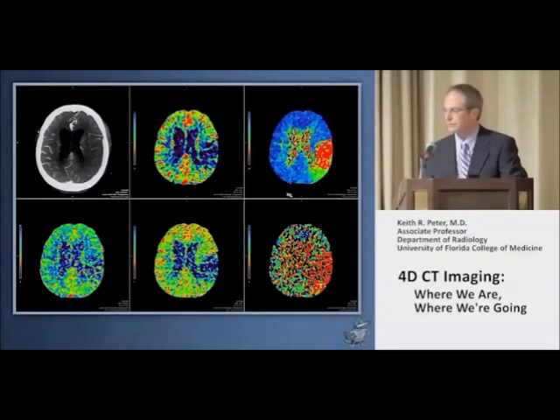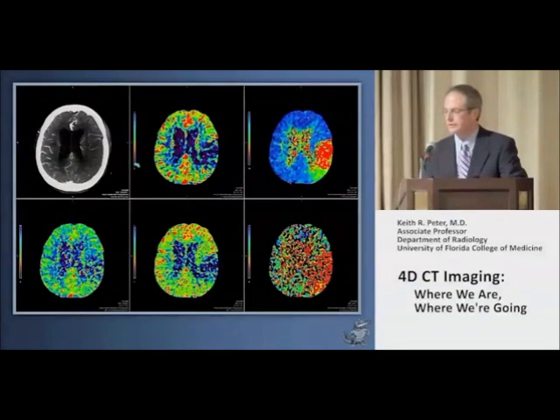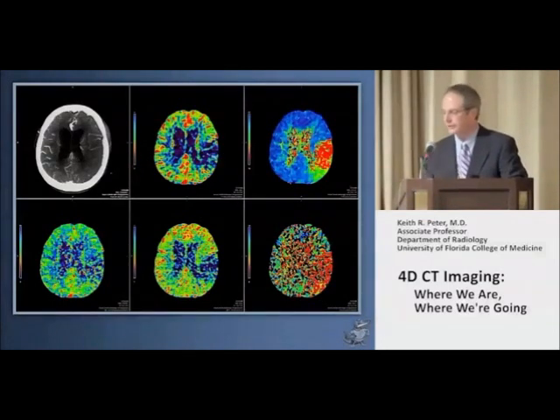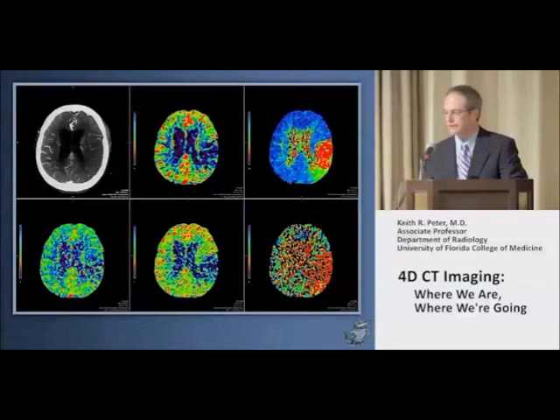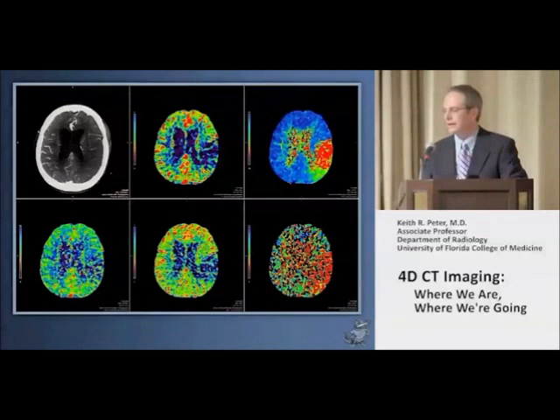Here you can see the maps we're looking at. We use the time to peak map to tell us where to look, then we go to the blood volume. The very dark areas — the very black and dark purple colors — tell us this is a very significant area of infarction. The mean transit time map is also showing that those same areas and the surrounding tissue, really everything, is down. We do not have a significant penumbra on this.